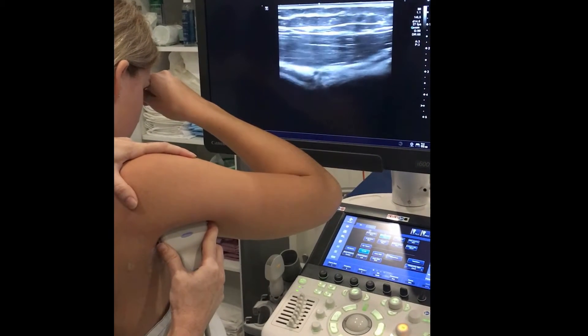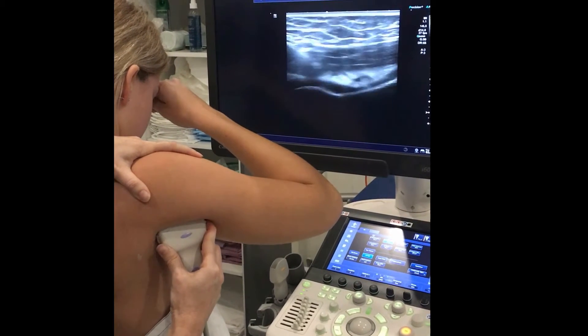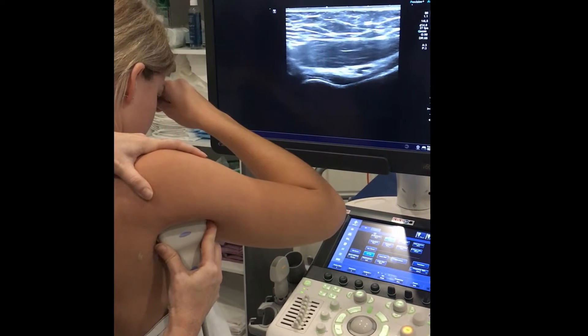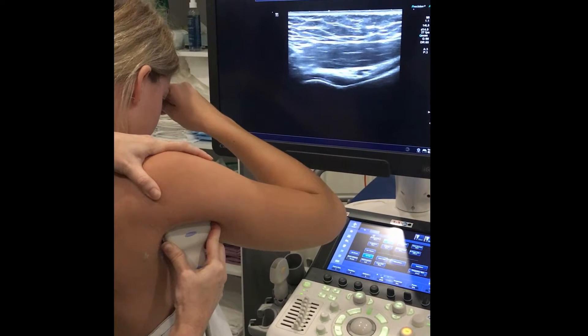It ends up looking like a femoral head-neck junction, so you can see the little ball on the left and the scoop on the right. That's where we measure over the humeral head.